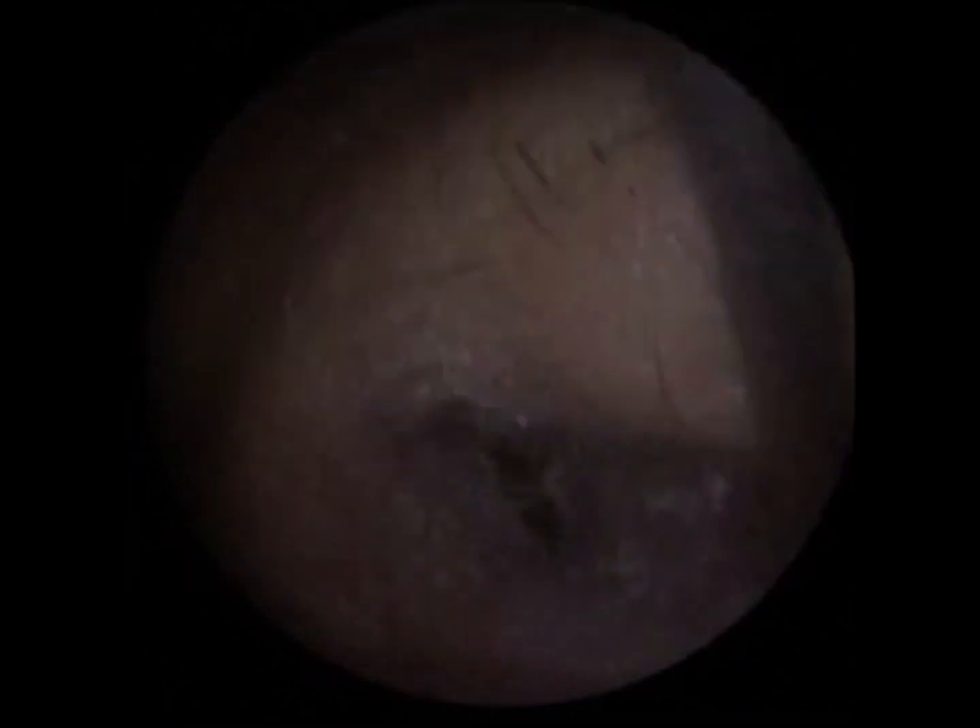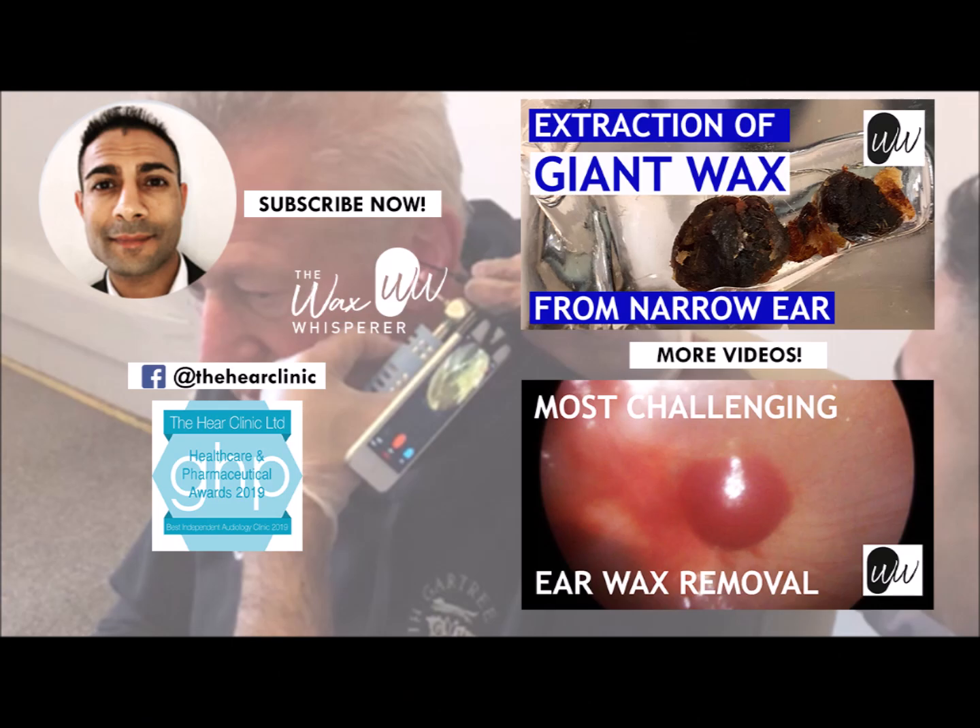Okay, I'm really pleased with that. I've got all that out. I've got it all classed into the video so you can see the full procedure. Thank you.